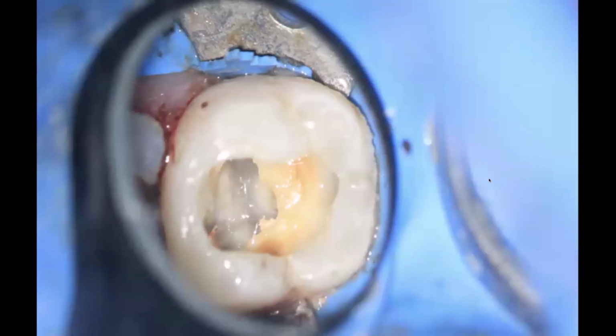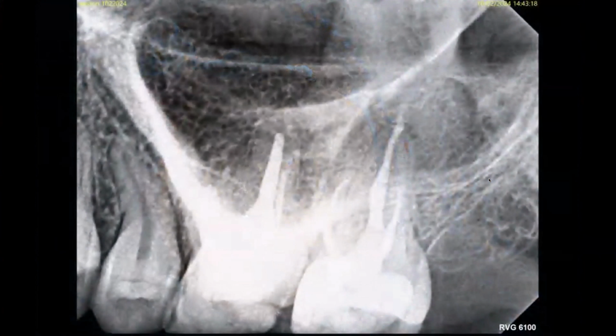The thing that I like about this strategy is it allows for the patient to leave with a good contact. For many of my patients, they're off to get a crown within a week or so, so I'm not too concerned about that. But there are some that are not, and in those cases, I really like to give them a good contact and a good margin. And then eventually, when they're ready to have their crown placed, worst comes to worst, if the dentist ends up placing their margin on restorative material, I know that I have a very, very good seal in the deepest aspect of the box.